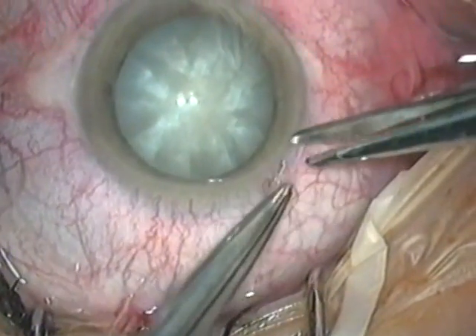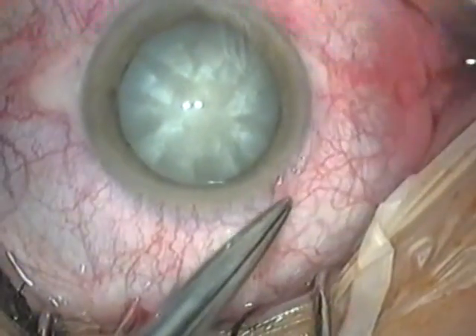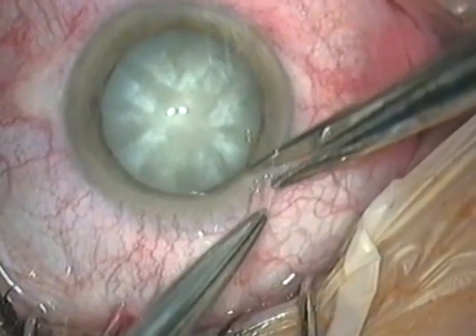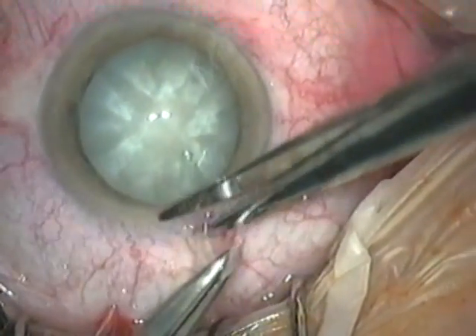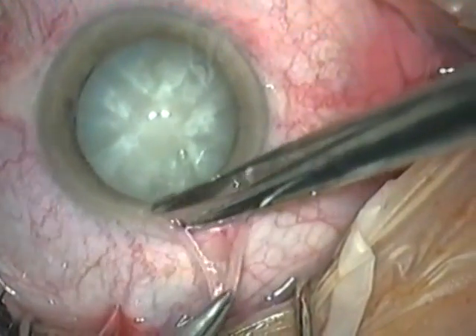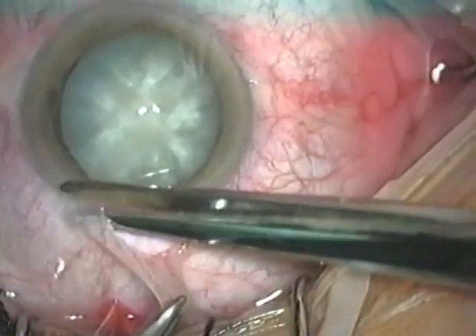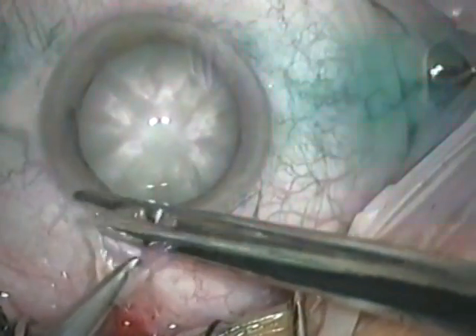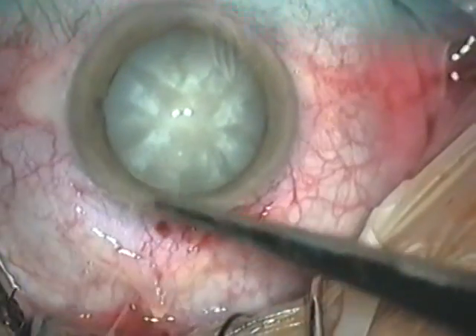The conjunctiva is picked up at the limbus with the forceps, and a small cut is made with scissors. One blade of the scissors is passed into this wound, and the conjunctiva is cut from the corner, keeping as close to the limbus as possible. You may occasionally need to gently detach Tenon's capsule from the sclera, but in many patients this will not be necessary.